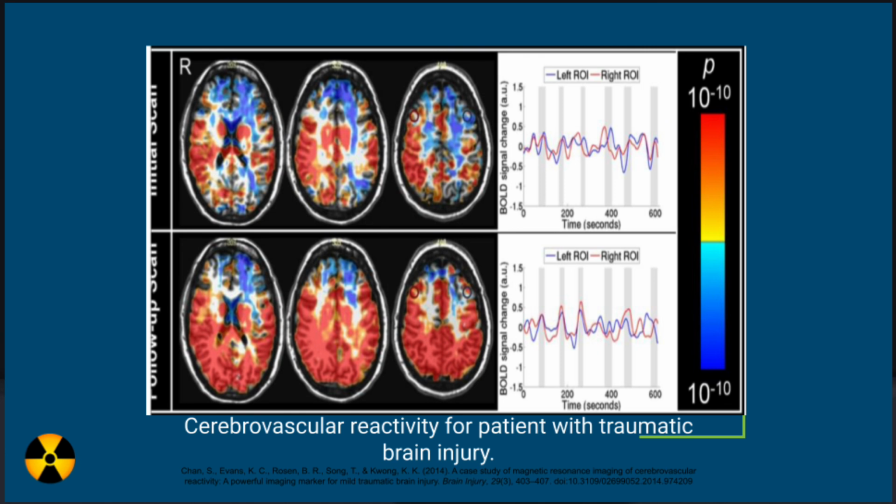A parametric map of CVR, cerebrovascular reactivity, is a test that uses MRI to measure how well cerebral blood vessels dilate and constrict in response to a stimulus. During the test, the patient breathes in a stimulus gas like carbon dioxide while lying inside the MRI scanner. The MRI monitors the corresponding hemodynamic changes in the brain. CVR is a key parameter for studying cerebral vascular diseases like stroke, small blood vessel disease, and dementias. It can also be used to assess vascular integrity and healthy aging.